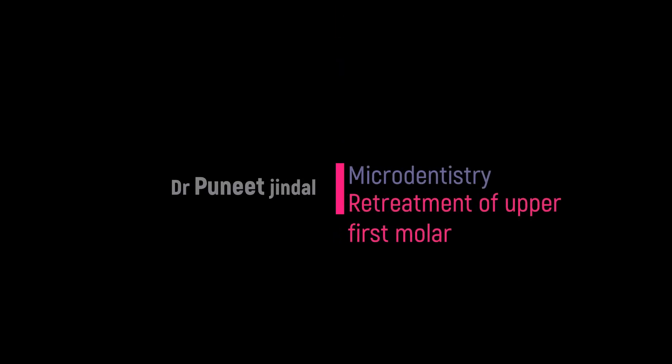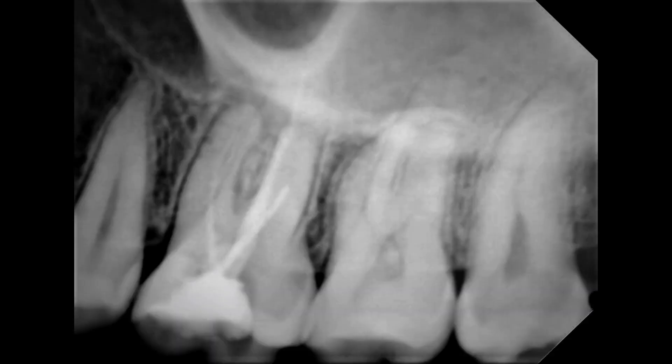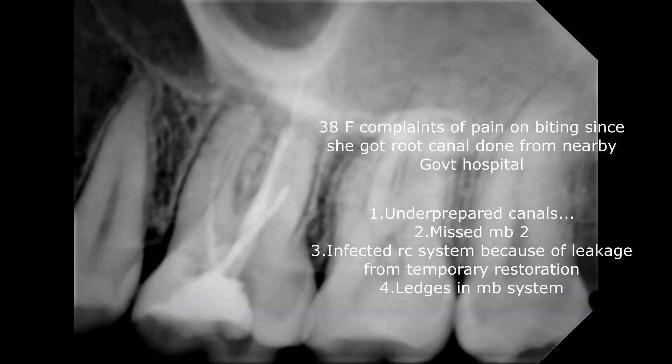Welcome to another video. Today we'll be retreating a maxillary first molar. She's a 38-year-old female who complains of biting pain. She had a root canal done at a nearby government hospital. As you can see, there are underprepared canals, the MB2 is missed, and the root canal must be infected because of the temporary restoration.